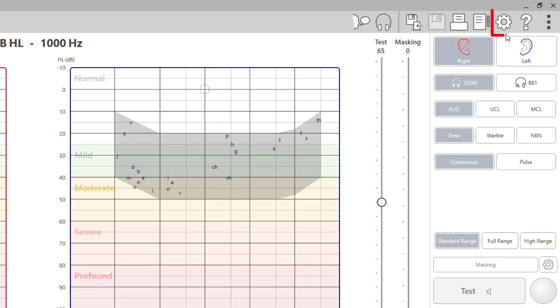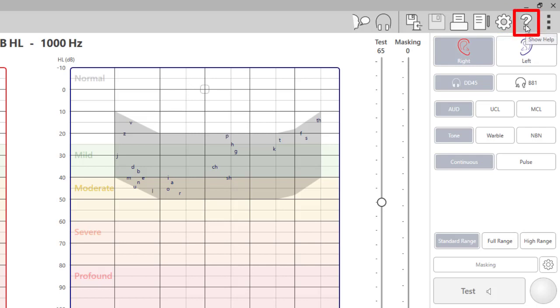The settings icon will allow you to set and change your default audiometer settings. The question mark icon will allow you to access help files for each individual test module. You can also search specific tests or topics in the search tab of the help files.